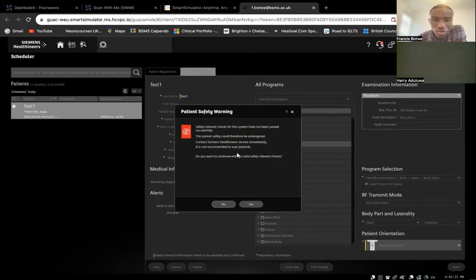Yeah, always messages popping up. You need to take your time to read through to understand what they mean. This popped up. I consulted the engineers. They said I'm okay to go ahead. So I'm confidently going to scan because it's a training platform.